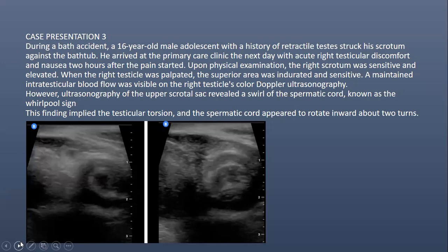So when you're doing a scan, you're already having something in your mind, you're building something. Okay, this could be this. It's important that as you scan, you already know what your end goal is. You have an idea, what am I looking for? What should I rule out first? So already you have some history guiding you. That's why it's important that you coordinate with the clinicians to get the proper history, so that you're also able to help them find the right answer to their clinical questions.